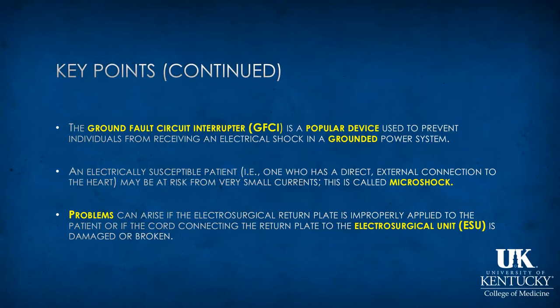An electrically susceptible patient, that is, one who has a direct external connection to the heart, such as from a central line, may be at risk from very small currents. This is called microshock. Where ESUs, or electrosurgical units, are concerned, problems can arise, complications in other words, if the electrosurgical return plate is improperly applied to the patient, or if the cord connecting the return plate to the ESU is damaged or broken.